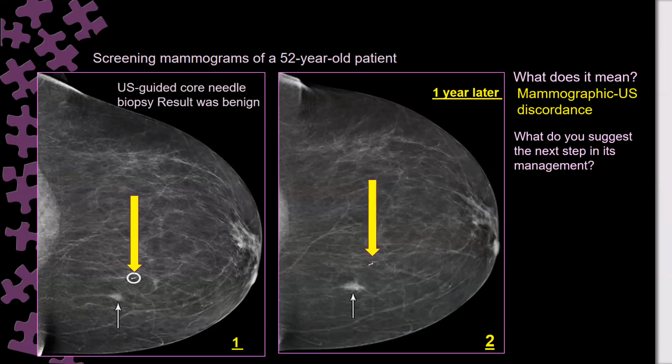Why MRI? The lesion is very clear here. This is a fatty breast. How is MRI going to help you in this case? What is the indication of MRI in this case? Here you need to take enough tissue biopsy from the lesion itself, from the suspicious portion. If it was difficult to take enough tissue from the lesion as it appears on ultrasound, you can place a wire and do an excisional biopsy.